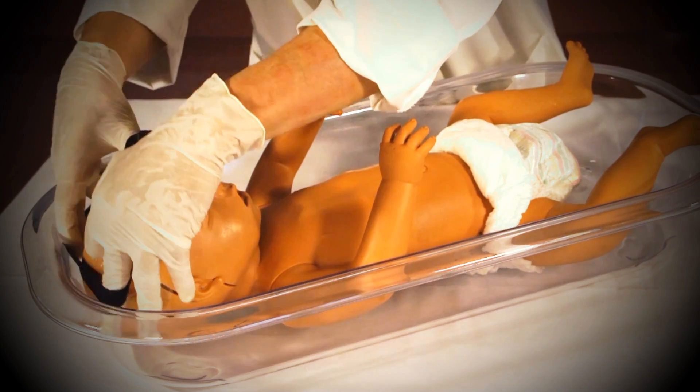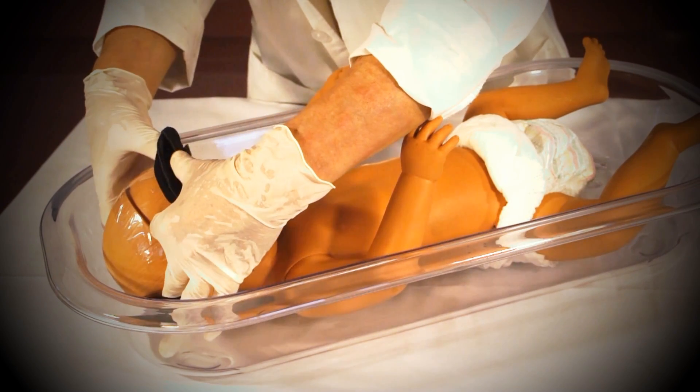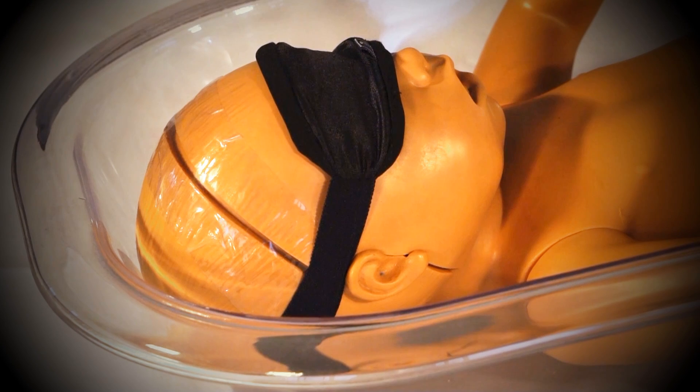Now cover the baby's eyes with an eye patch or eye mask. All babies receiving phototherapy must have their eyes covered during the entire time they are exposed to the phototherapy light.